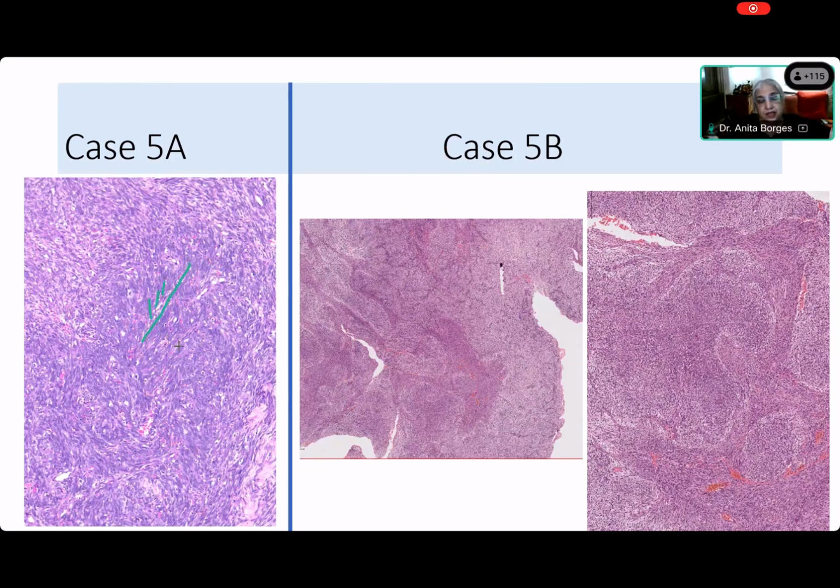These are just fascicles that are radiating away from an area. Okay, come on. What are you seeing now on the other side? They're also arranged in fascicles. Okay, but what kind of? These are just in haphazard fascicles on the left hand side. On 5B, what do you see? We've seen this pattern before. No, this is in sheaves. We saw that this is a sheaf.